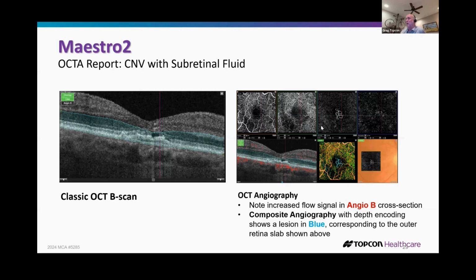So for the cataract workup, maybe instead of conventional OCT, to make absolutely sure, take that extra 10 seconds, do an OCTA, just sweep that macula, make sure everything's flat and dry. You don't want to be surprised after the fact. As we know, that happens sometimes.